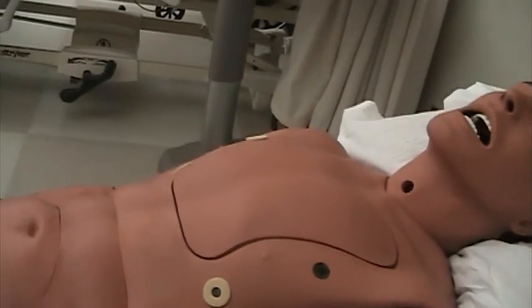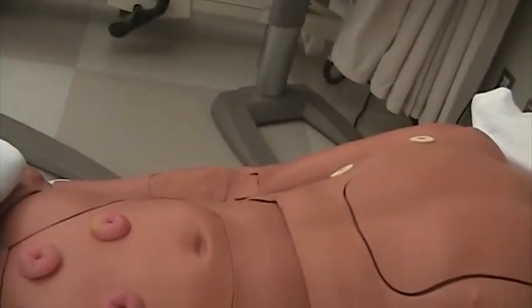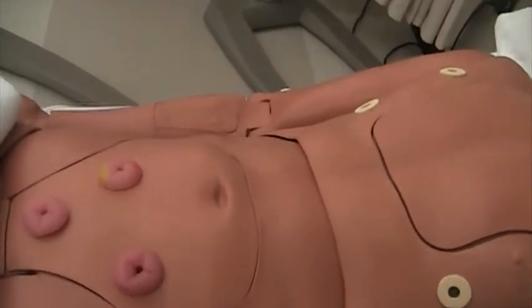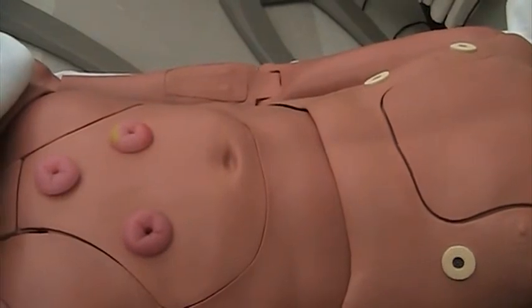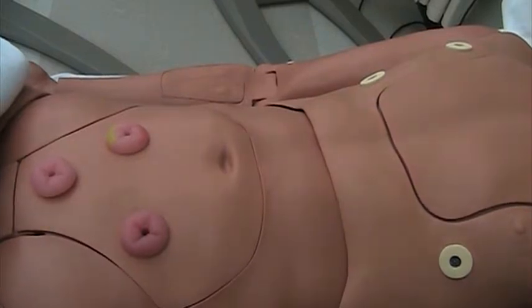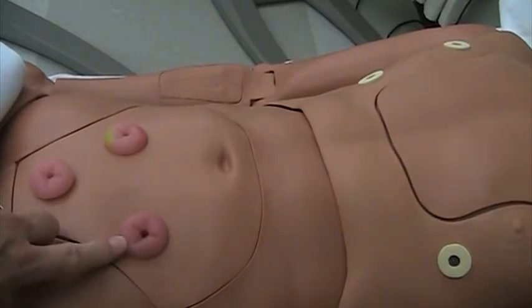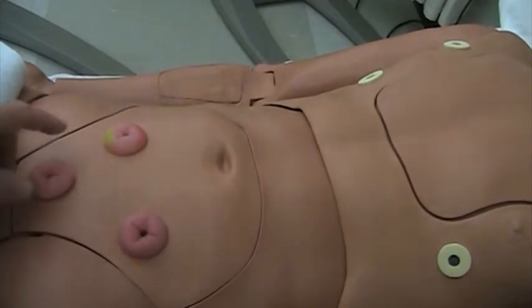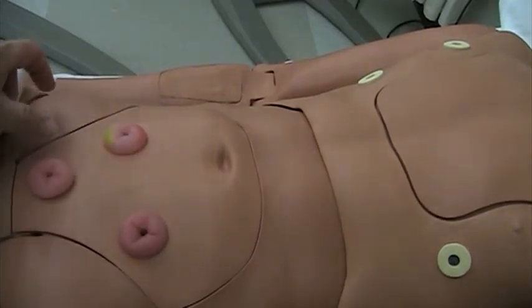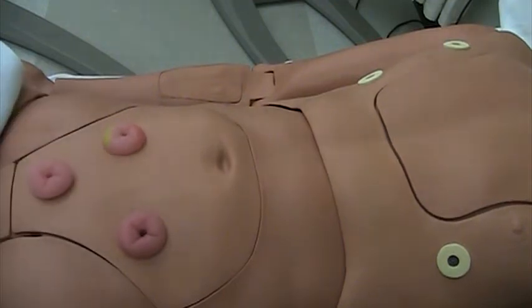So what I have here on the model is representation of ostomies, to be more specific, stomas that you see on the abdomen. Okay, so here's three. And for the most part, what you see here would be maybe a sigmoid ostomy. This would be an ostomy that's on the descending colon, and here maybe you have an ostomy that is either on the ascending colon or even an ileostomy, small intestine ostomy.